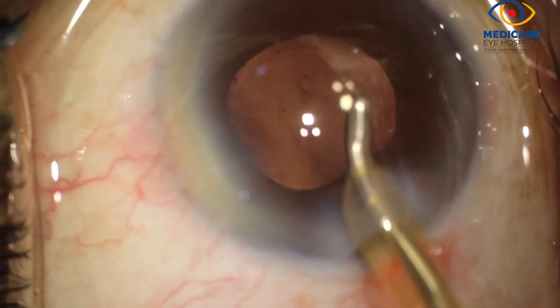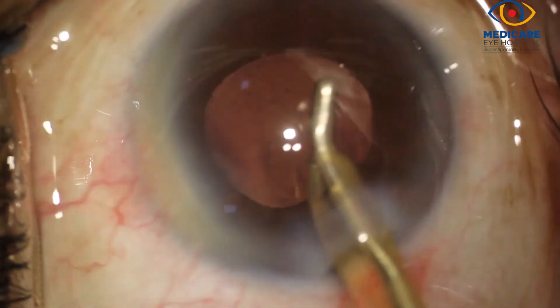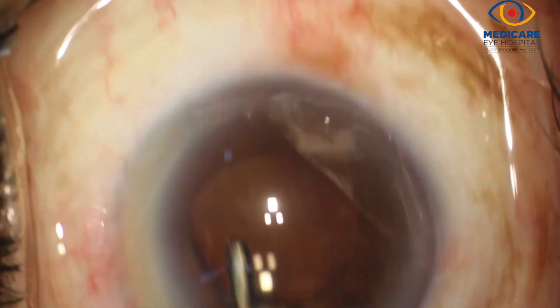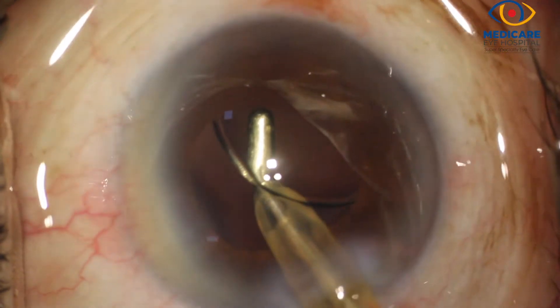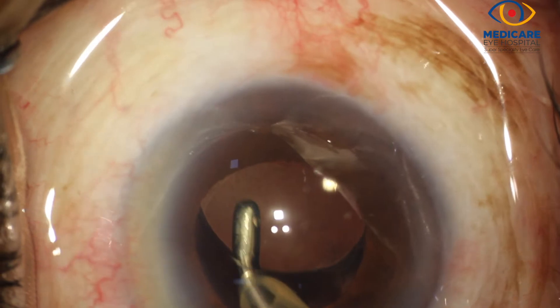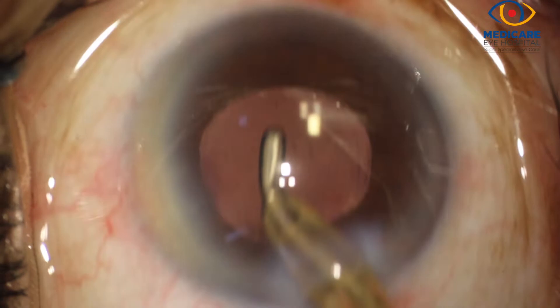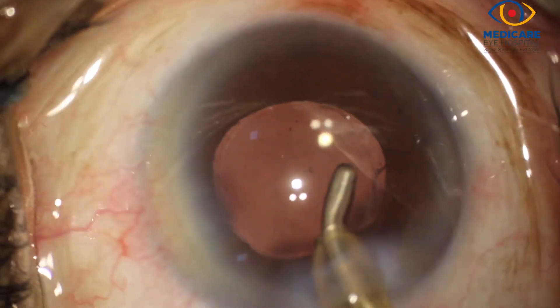The viscoelastic is removed from behind the intraocular lens to prevent capsular distension on the first post-operative day. This is a very important step — we must ensure complete removal of any remaining viscoelastic. The main incision and side port are then hydrated to complete the surgery.